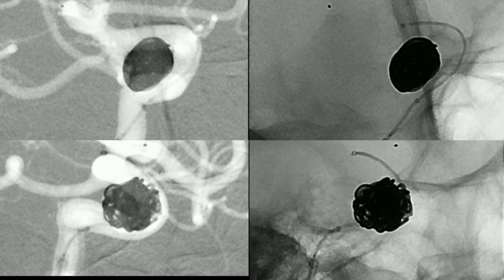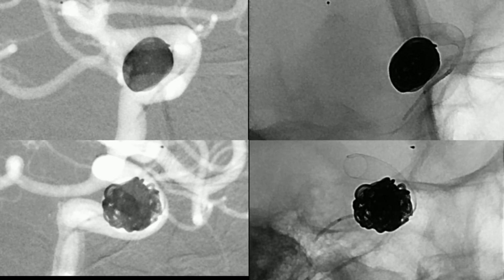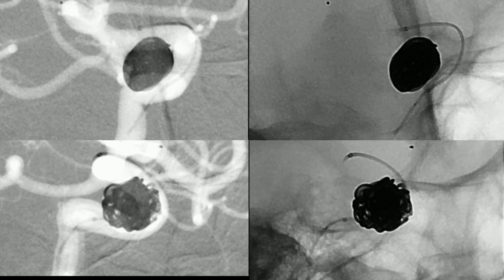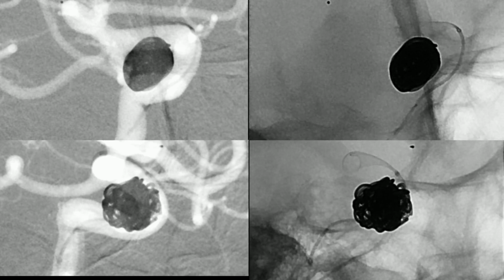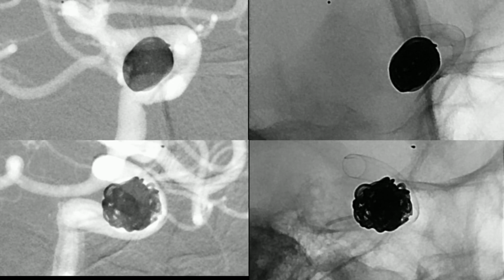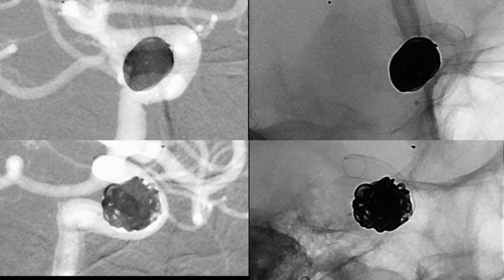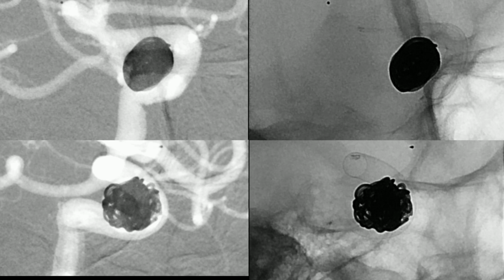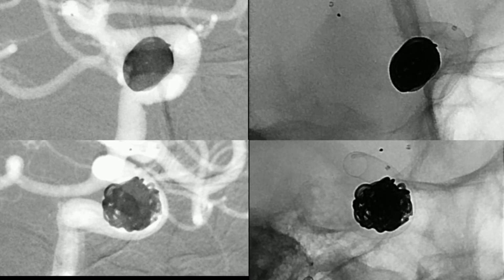And here we start unsheathing the flow diverter, but as you can see, it slipped a little bit back, so we resheath the flow diverter and put it a little bit distally from this position, and now we continue unsheathing. There is a little bit of narrowing of the flow diverter in the middle. We can correct it with the microcatheter, and as you can see, it has opened well, and we push the microcatheter inside the MCA to have a stable position.